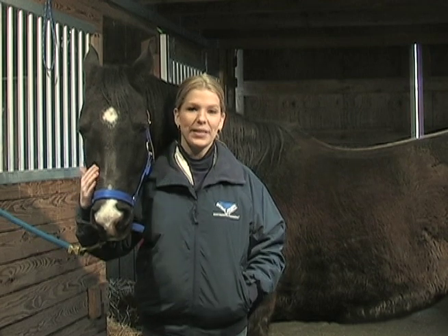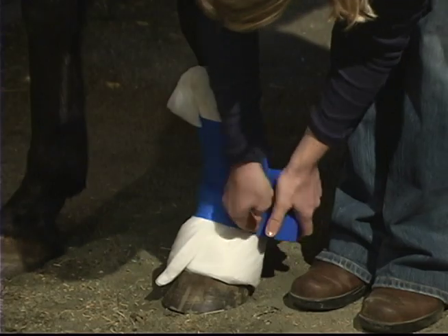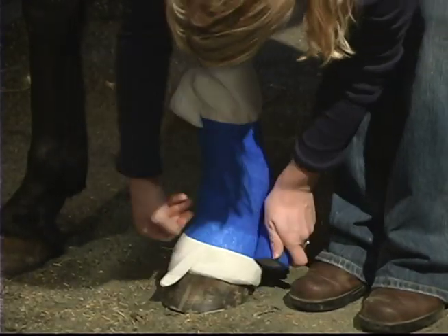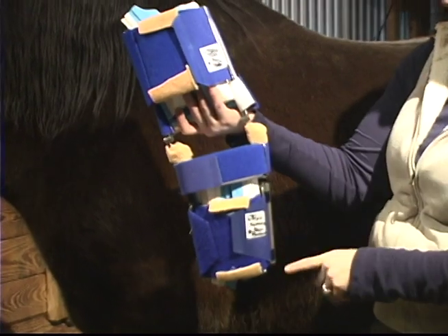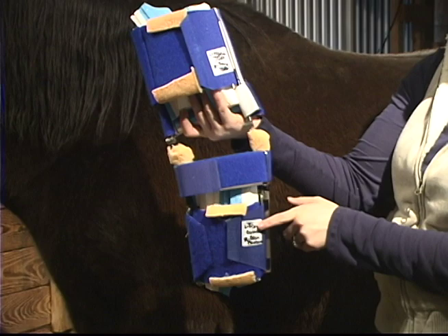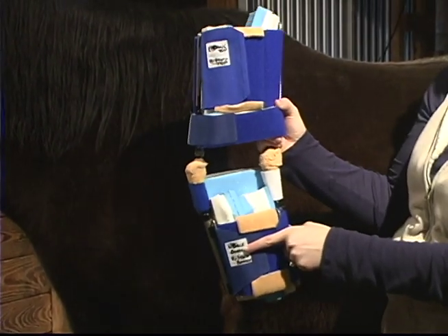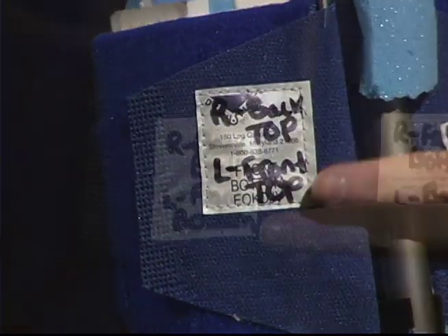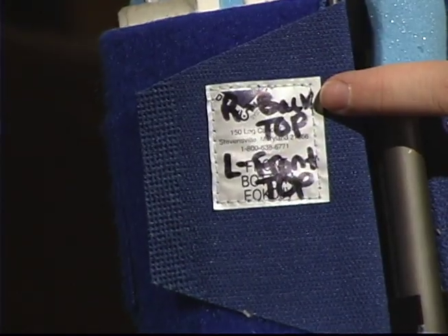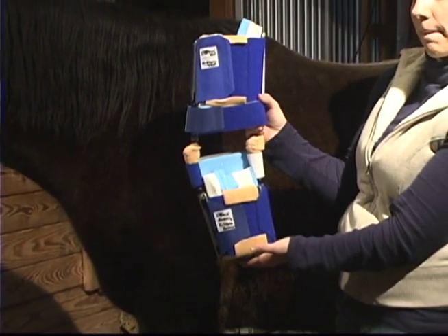Before applying the Dynasplint system, please speak with your sales consultant about adding a wrap underneath the splint. Wrapping is not always necessary, but since each horse is unique, wrapping can sometimes prevent further complications. Your Dynasplint consultant has labeled the splint according to your animal's condition. If both legs are affected, in some cases the same splint can be used for both. You will see an L for left leg and an R for right leg before each front top, front bottom, back top, and back bottom label. Follow these labels when applying the system.